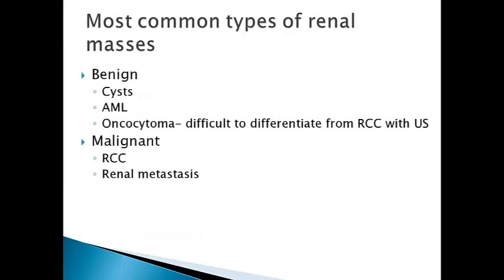These are the masses we're going to talk about today. These are some of the most common types of masses. These are the ones I'm going to focus on, like I said, because of how ultrasound can be used with them.